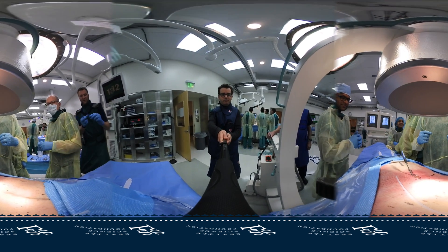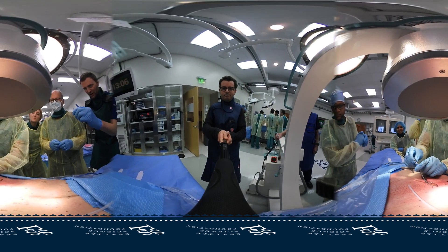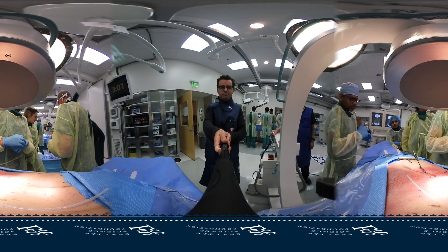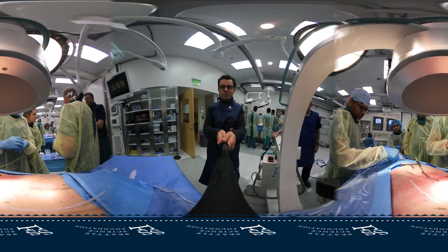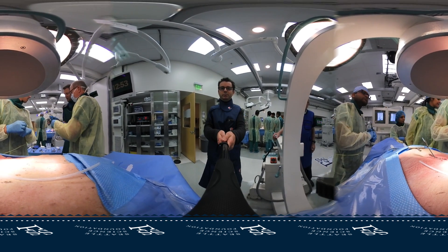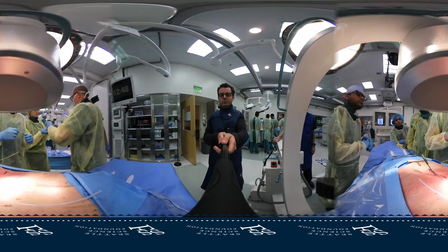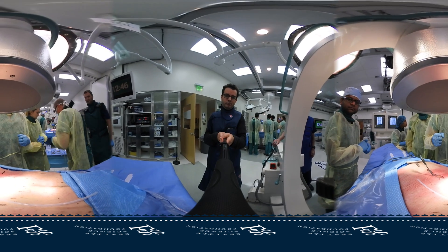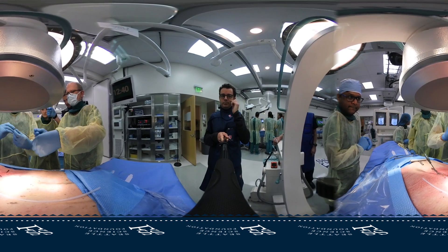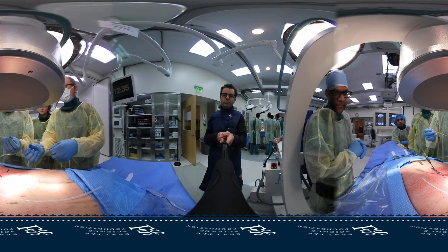Now what you're going to do is pull that one out like that. You're going to hold this together again and pull that all the way out. You put the anchor on first — so we put the anchor on first, push it all the way to the back. The reason is, once it's in, you cannot put the anchor over the place. So we always make sure the long part — which it is — is towards the patient's head of the anchor.